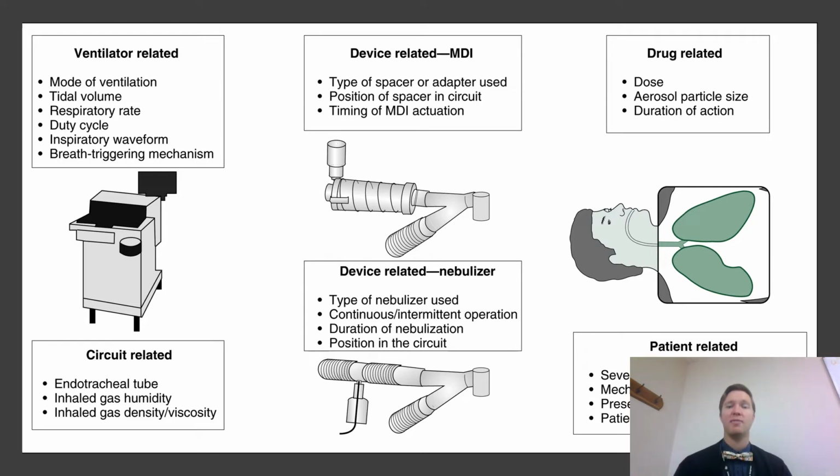What's their tidal volume? Is their tidal volume already big? What are their pressures, right? Could they have an increased peak inspiratory pressure with nebulizing using a pneumatic nebulizer? Absolutely. Respiratory rate, their cycle, the waveform that you're giving can make a difference at how that medication is delivered. And even their breath triggering that we've already talked about, that sensitivity, could be a big factor for using a pneumatic nebulizer.